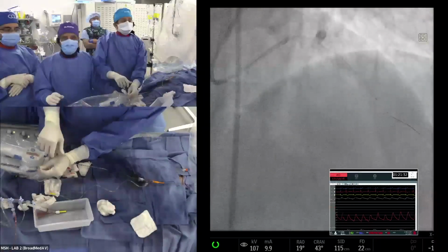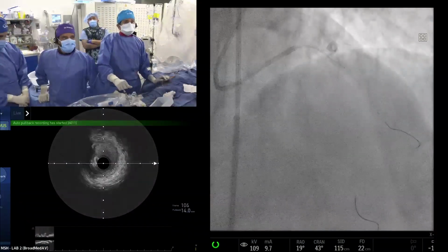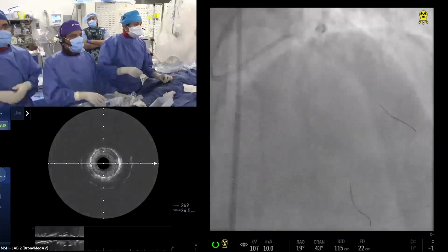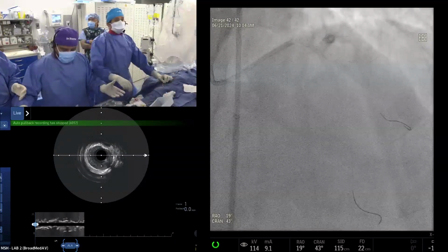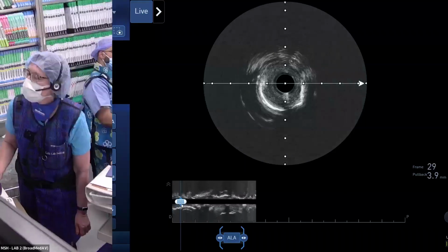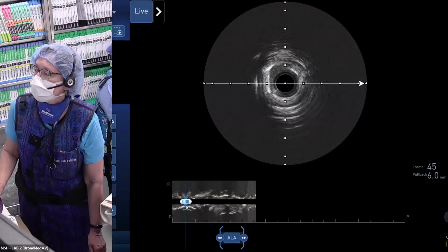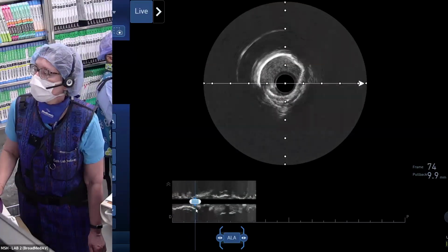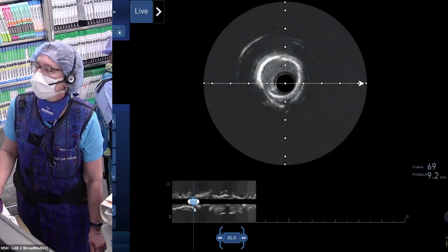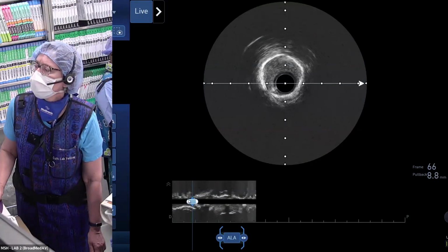Okay, now we are ready for IVUS? Yes. Show the IVUS, please. Good. Okay, let's study the IVUS. Right. So that's a tight... What is this? This reverberation probably results of our... Yeah, go back. 360. Yeah, right there. Very 360 calcium. It's still circular calcium. Still circular, no break. Well, there's a little probably break here. So that's okay. We expected that.